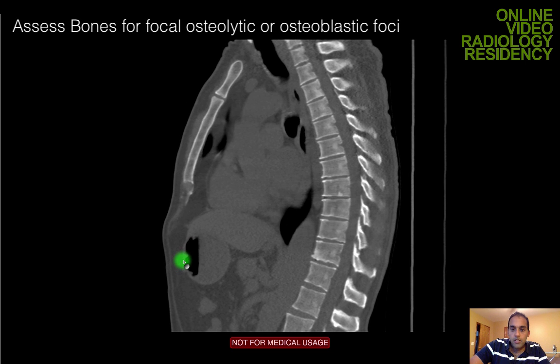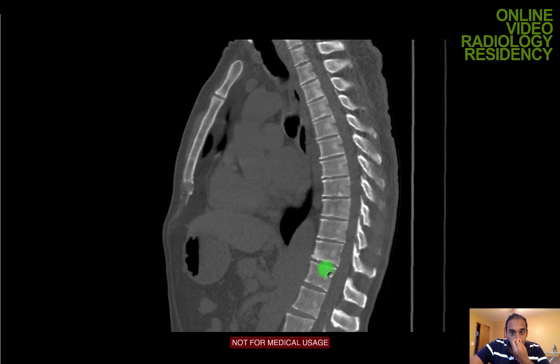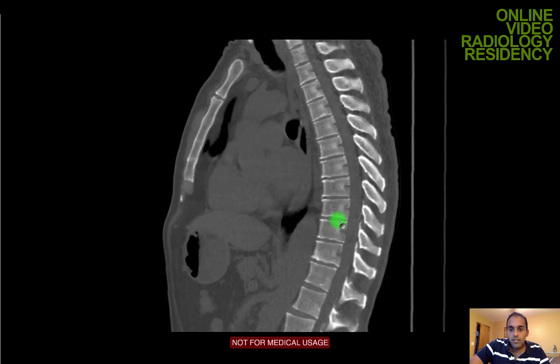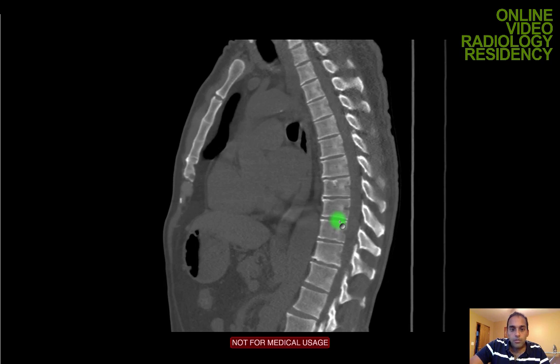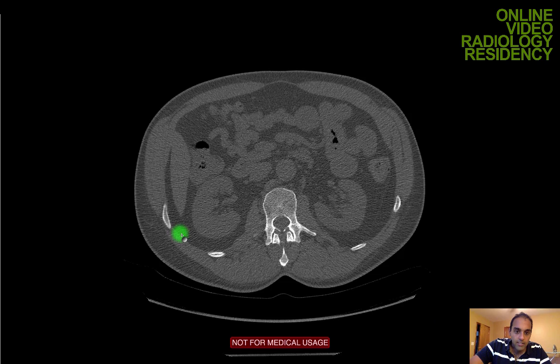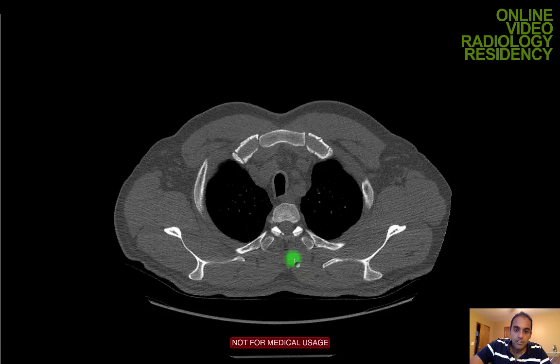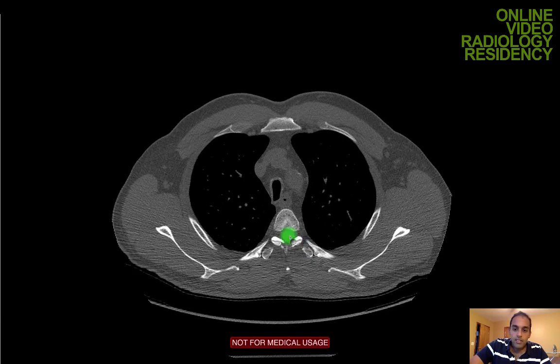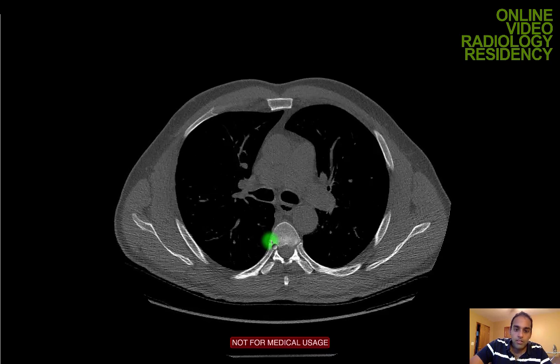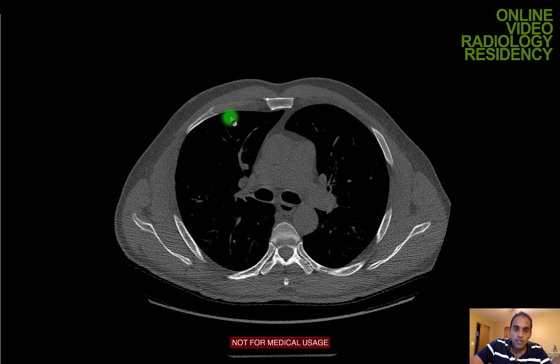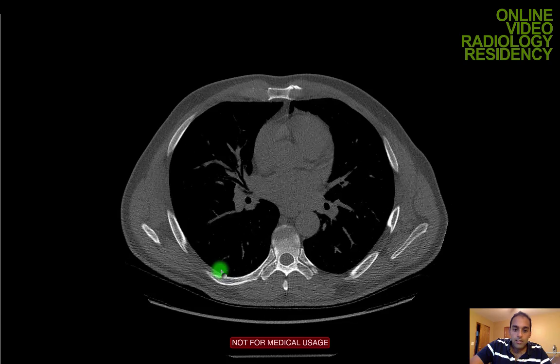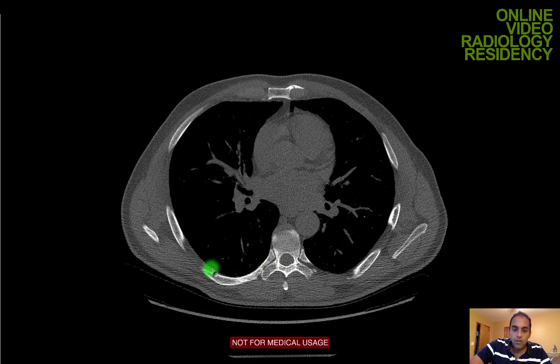I like to look at bones on the sagittal plane for a nice long axis of the thoracic spine to assess alignment and look for focal osteolytic or osteoblastic lesions — metastatic lesions usually involve the spine. In bone windows on thin section axial views, I look at the scapula, clavicles, ribs, and thoracic spine vertebral bodies — looking for focal lesions, healed or acute rib fractures in the setting of trauma, and marrow expansion.